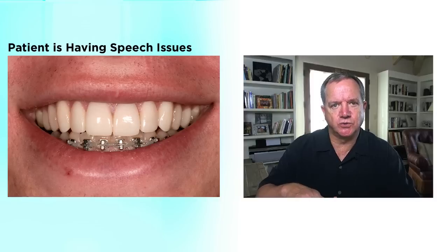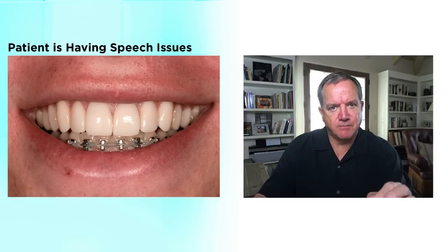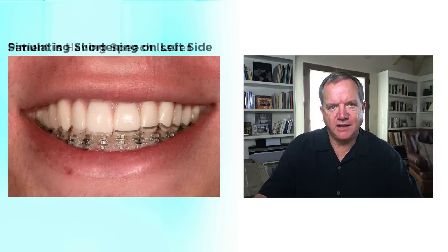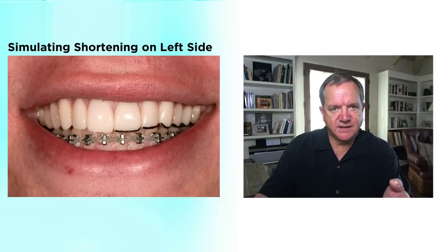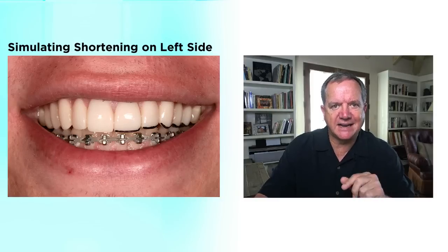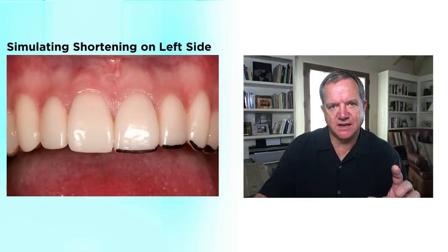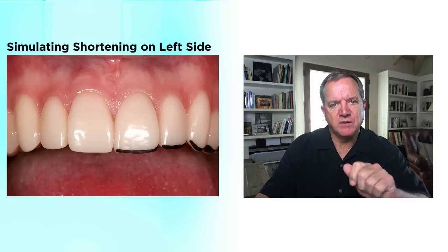I want to make sure I shorten them in a controlled way so they look good, and then we try it again phonetically. The tool I use the most to help with that is a black marking pen — a Sharpie. On the left side — the left central, lateral, canine, and premolars — I've taken a black marking pen and adjusted the length by blacking it out. Now I can look at that left side, and if I like it, I can replicate the right side. I do it with a black marking pen so I can really control how much we're taking off.